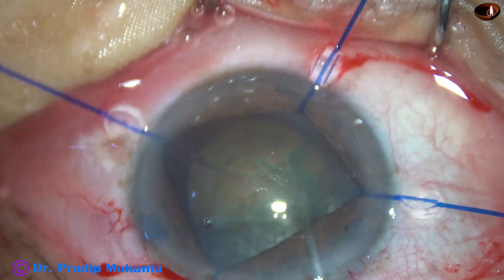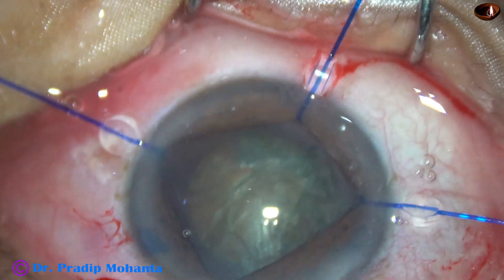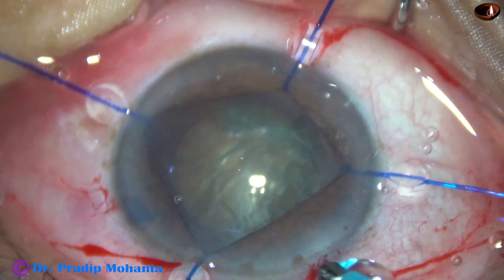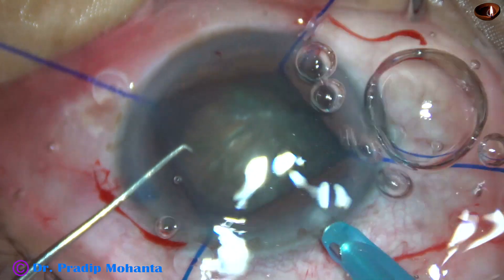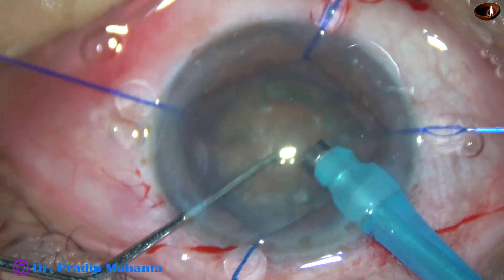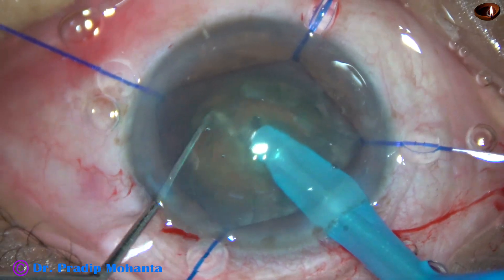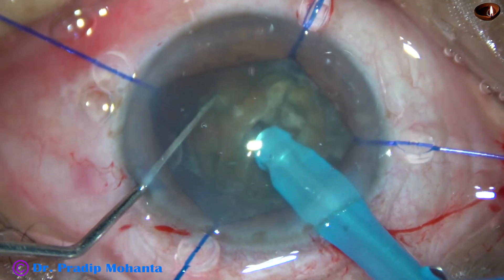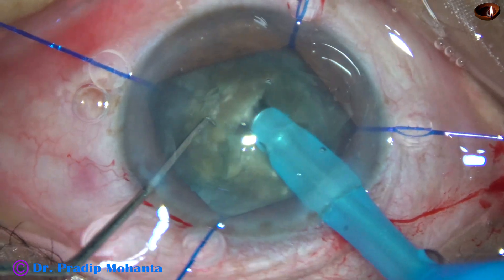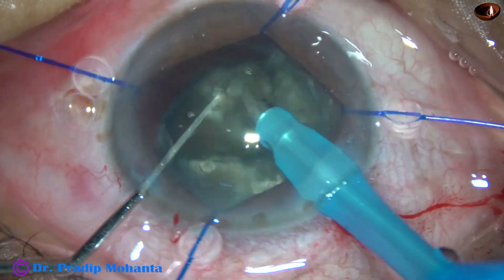I depressed the nucleus and there was some trapped fluid behind the nucleus — it came out. Now I inject visco and introduce the tip of the phaconeedle. The phaconeedle goes bevel down — never bevel up in such cases — and gently glides over the iris. Now I start chopping the nucleus to divide it into several fragments, and then I start emulsifying the nucleus.